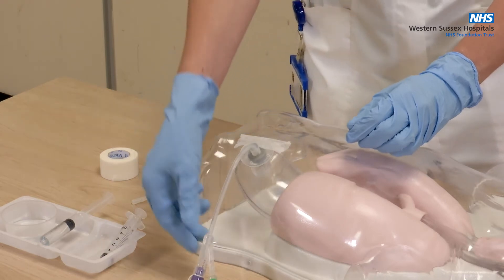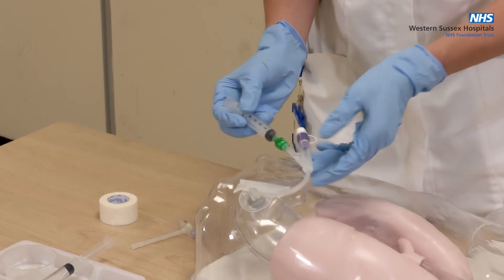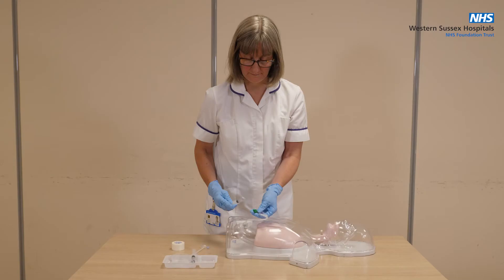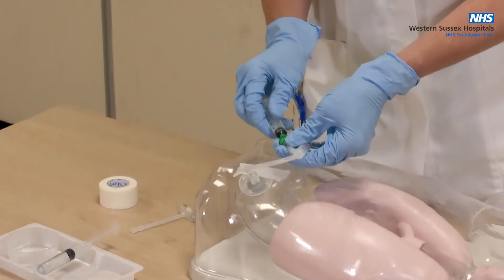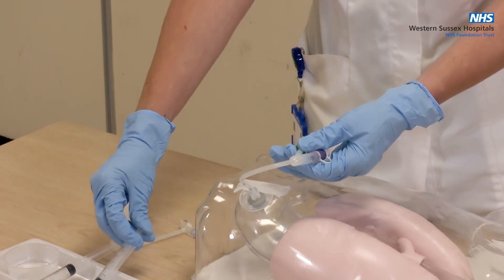To remove the balloon water, attach an empty Lewa slip syringe to the inflation port. Gently draw back on the plunger until all the water from the balloon has been removed. You may want to check twice. Make a note of the volume and colour of the fluid removed and discard.